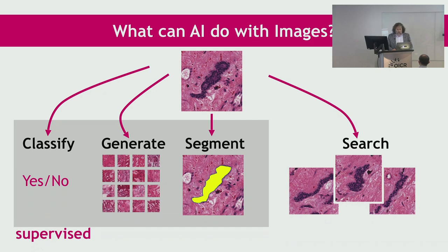You see some of the public databases, you grab 200 images, two pathologists mark them, you break them down into tiles and patches, you run some experiments with patches, and then you publish a paper. We report 98% accuracy. Everybody's happy. Well, in computer science, that's of limited use to actual pathology.